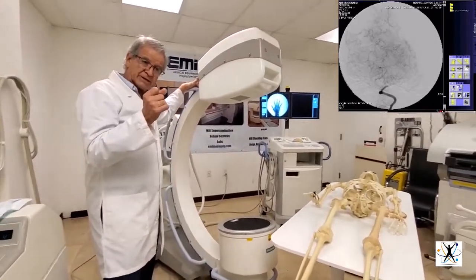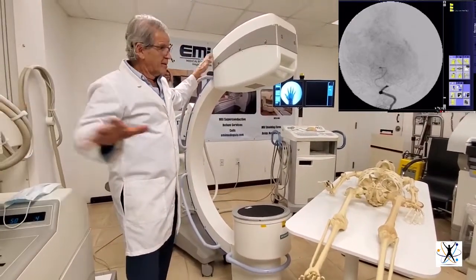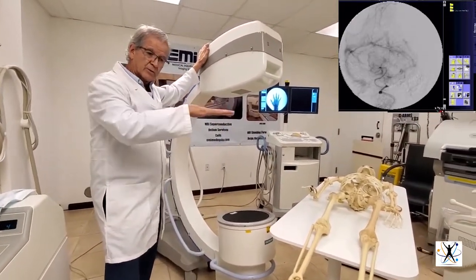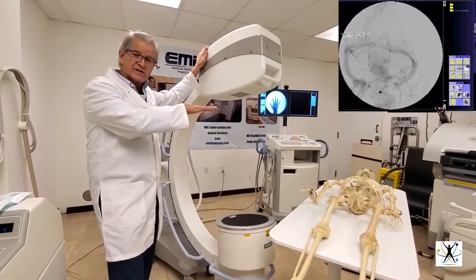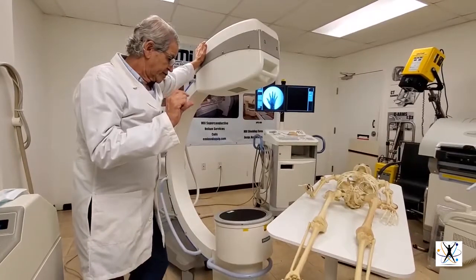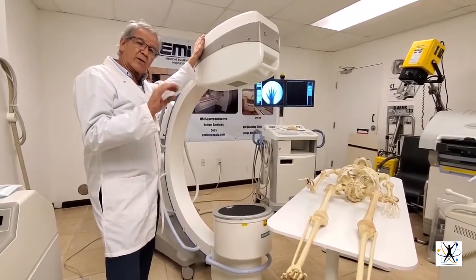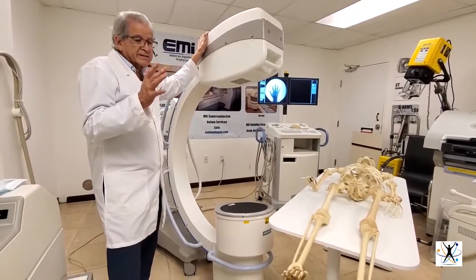A regular X-ray machine does one shot, but this one can do fluoroscopy, which is like video — many shots in a very short time. Fluoroscopy uses very low kV and low mA, so the radiation is not so bad.